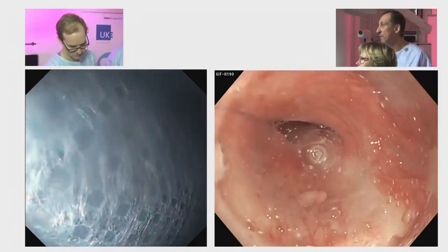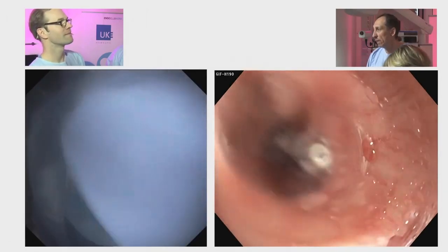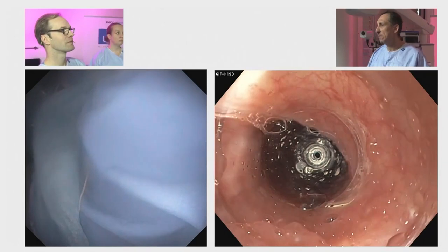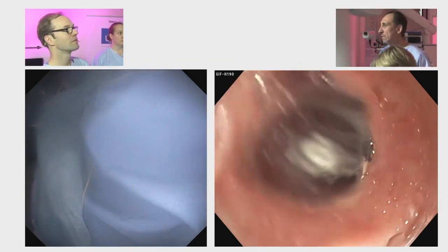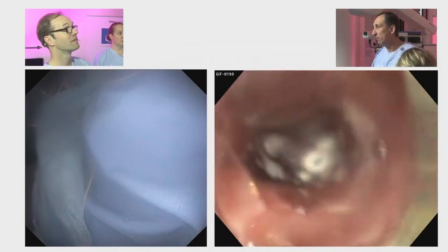Here we've already got the 14 mm one, and what we can see is you can introduce it very nicely — it's not really a big problem. And what we can see here at the front in the center is this hole, which is for a wire, that you could lead a wire through if you wanted to.